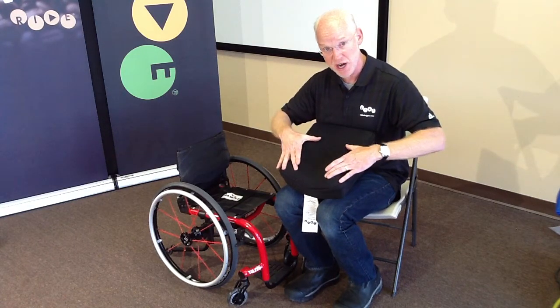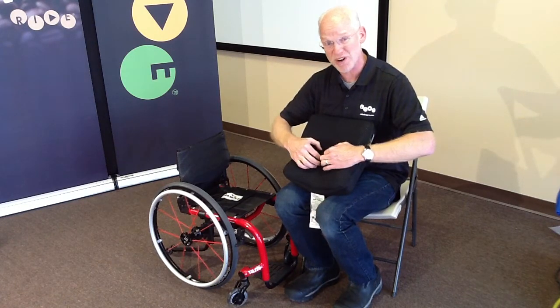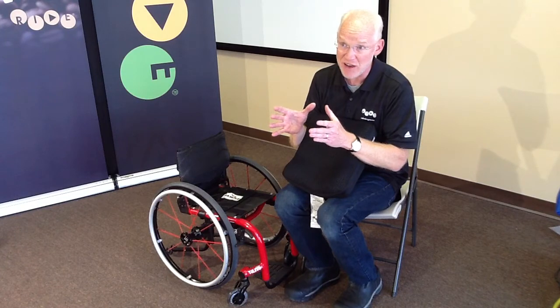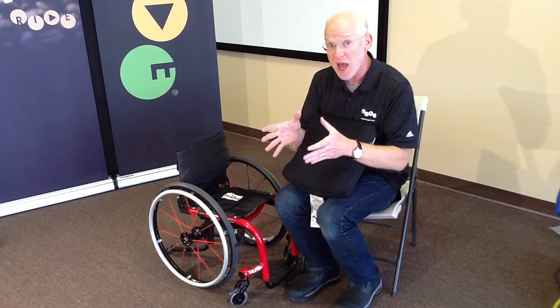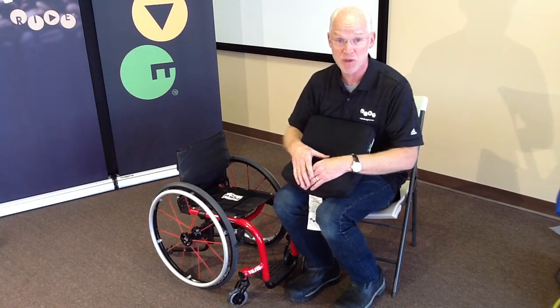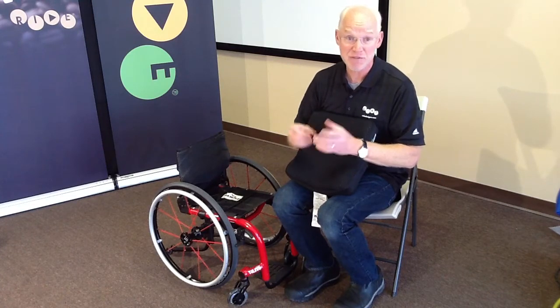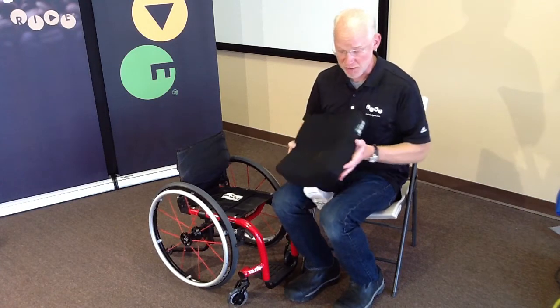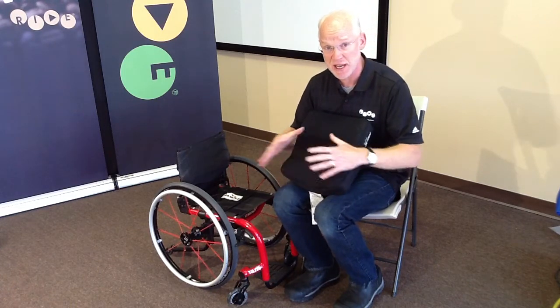By controlling posture here and using the forces of support to do so, we can then move those forces of support away from areas at higher risk for skin breakdown. Although our children tend to have goals biased more towards postural control, growth and change, function, we have to recognize that anybody sitting with any degree of immobility has some degree of risk for skin breakdown. So our progression of cushion products will provide varying levels of postural control and skin protection from simple to complex.